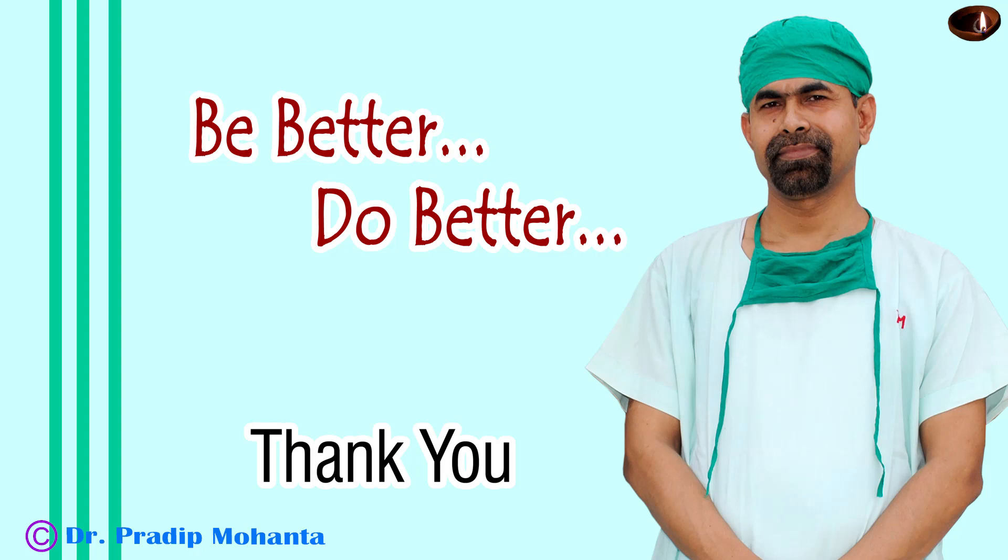Thank you very much for your attention. In this case we decreased the bottle height, we decreased the parameters — that is vacuum, flow rate — and we used optimum ultrasonic energy. We didn't rotate the lens vigorously. All these precautions are taken to manage this case. Hope this video will help you in managing your cases when you face such a situation. Thank you.